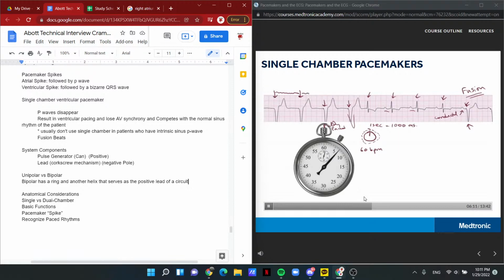That starts the clock again, and when the clock runs out, the pacemaker paces the heart again. If you measure the time between two spikes, you can tell what rate the pacemaker is set for, because that's how long the clock is running for. In this case, the fourth beat is also paced, but watch what happens when the patient's own heartbeat occurs.